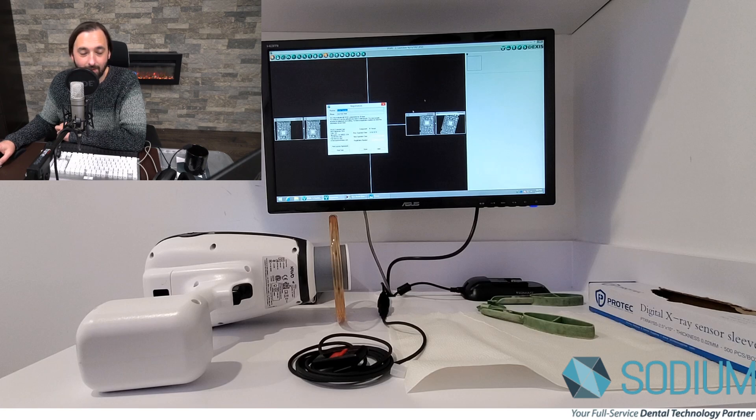You pay for it once and then you've got it forever. I wish they would just give this feature to their customers. I mean, you paid enough for their imaging software — I think you deserve to not have to continue to pay every time you want to use a feature of the imaging software you already paid for. But that's not my business. So let's go ahead and watch how quickly this goes through.